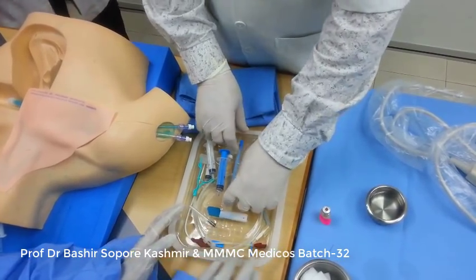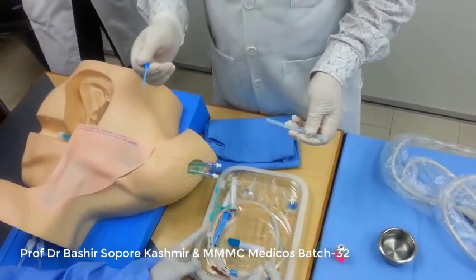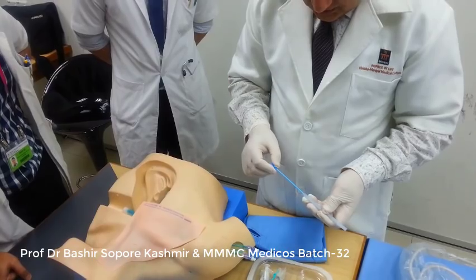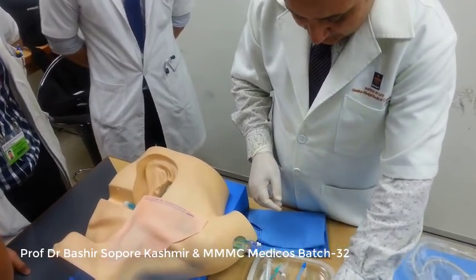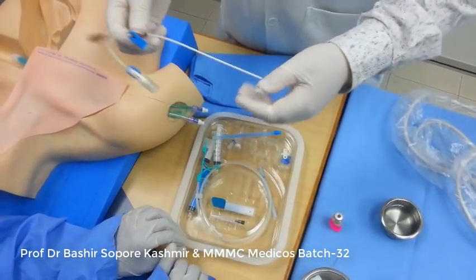another item in the kit, which is called the dilator, and this is used for dilating the subcutaneous tissue. It should not be advanced too far. It should be advanced only 1 centimeter or 1.5 centimeter, because the internal jugular vein is so superficial.